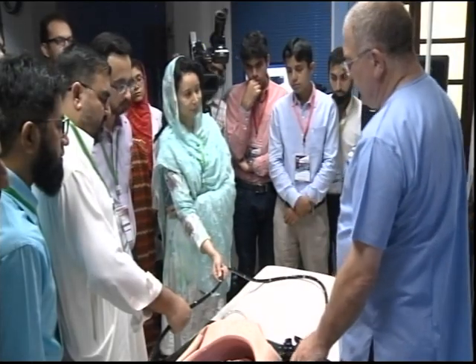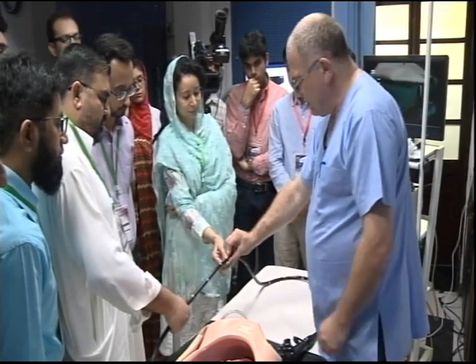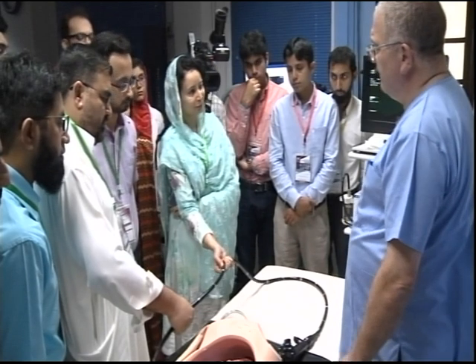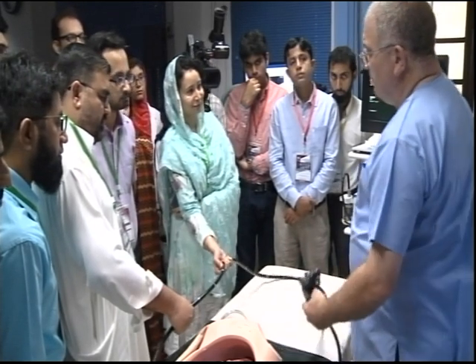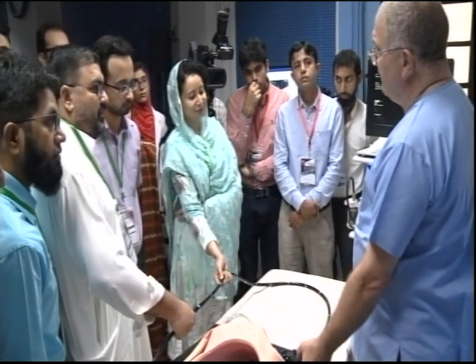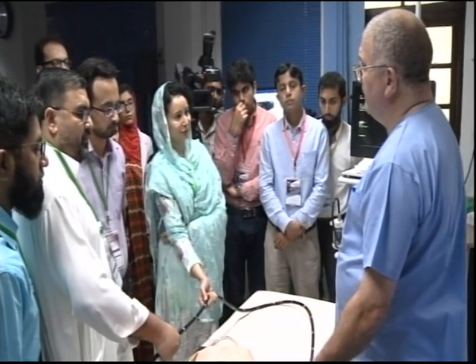A lot more. No, not with your wrist. Hold the scope here and bring it round. Go on, keep going. How does that feel? Not rigid. How does that feel? Not rigid. How does it feel? A little bit rigid. Okay. How does it feel now?